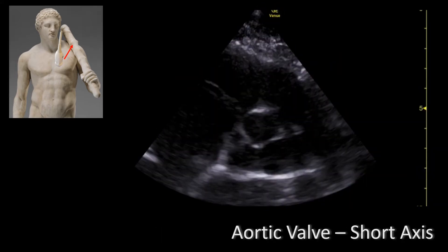Here's the aortic valve in a magnified view. There are two ways you can get this image: you can either zoom into the aortic valve from the image you had earlier, or you can decrease the depth. In this particular case the examiner decided to decrease the depth to 10 centimeters. The aortic valve in short axis is commonly described as the Mercedes-Benz sign, which I'm going to outline right now.